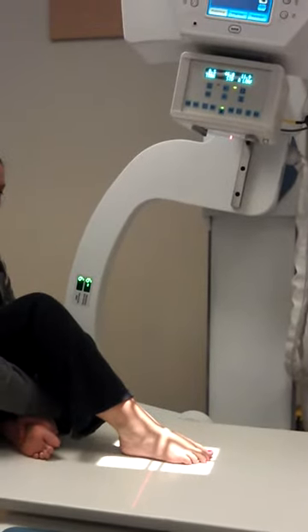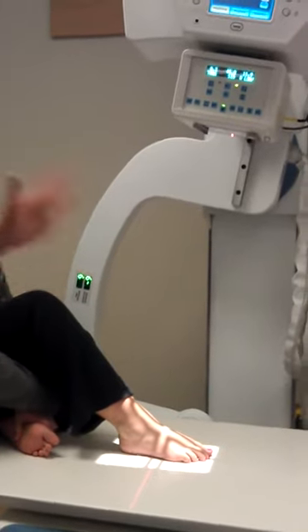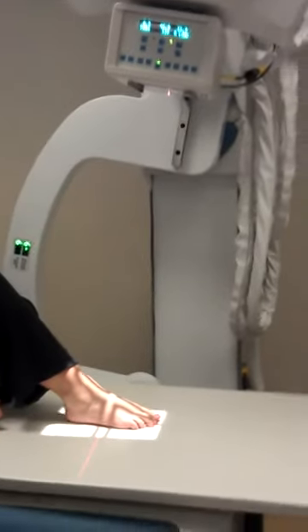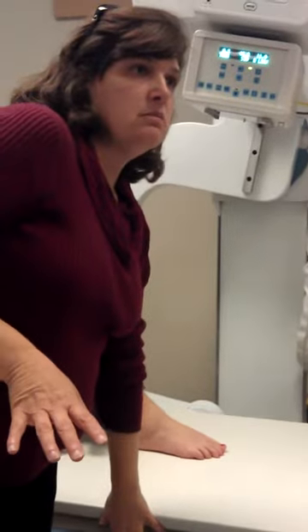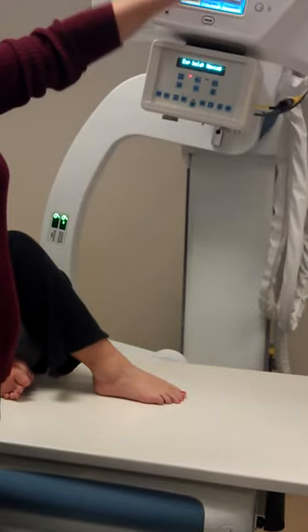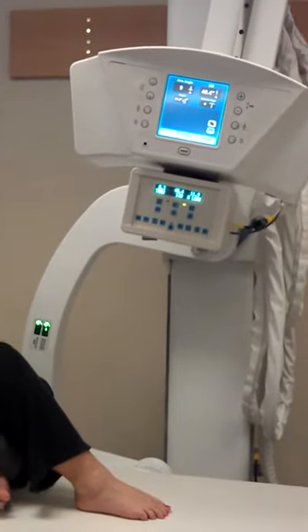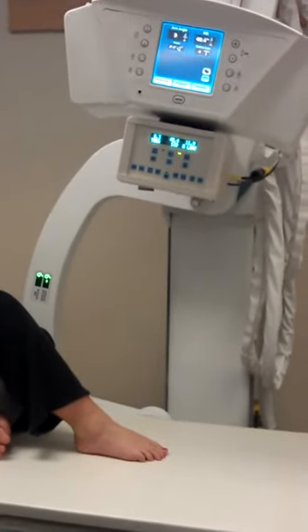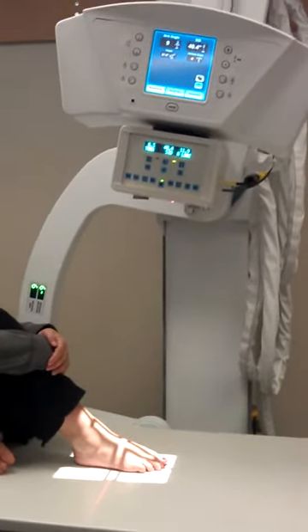It changes the SID too. I raised it up to show you that it's going to collimate back down. Everything should be shot at 40 because we're using this for everything. There is no tabletop — everything's done in the bucky. To show you it's going to re-collimate to whatever you set it to, no matter how high you do it.